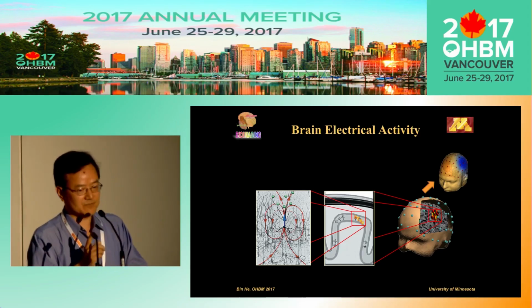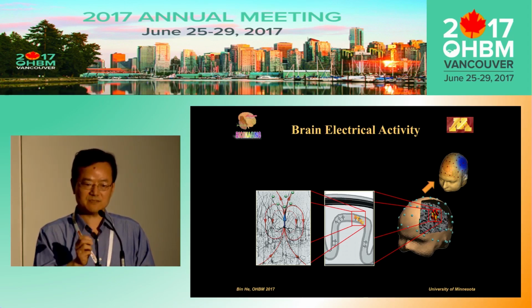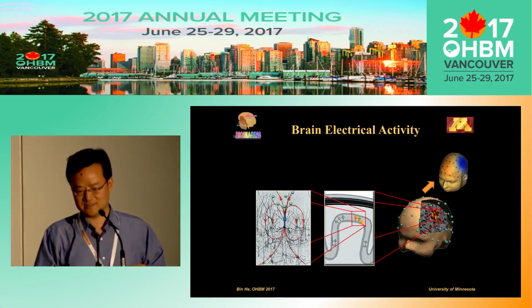Therefore, EEG MEG source imaging, or electrophysiological source imaging or connectivity imaging, is essentially a functional neuroimaging modality. It tells us function or dysfunction of the brain, although it doesn't tell us single neuron excitation. If we remember what we learned in physics course, I don't care what the Brownian motion of a single molecule is. I do care about the temperature of this room. So if you are interested in the macroscopic metric, EEG MEG is a solution. If you want to know the very, very fine detail, then this may not be the solution.